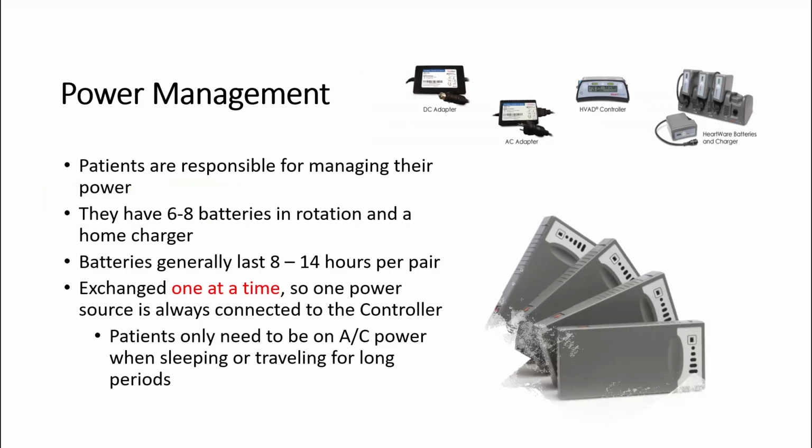Very important for both types of devices, whether it's the HeartMate or the HeartWare, is power management. So patients will have 6, 8, or more of these batteries. And they'll keep them on rotation, very much like we used to do when we had a bunch of LifePak batteries. They'll usually have a couple extra sets with them if they're traveling and they have a bucket list to knock off. They want to see the grandkids. They want to see the Grand Canyon. They want to see the world's biggest ball of twine or biggest wad of gum. They want to go out there and do it.